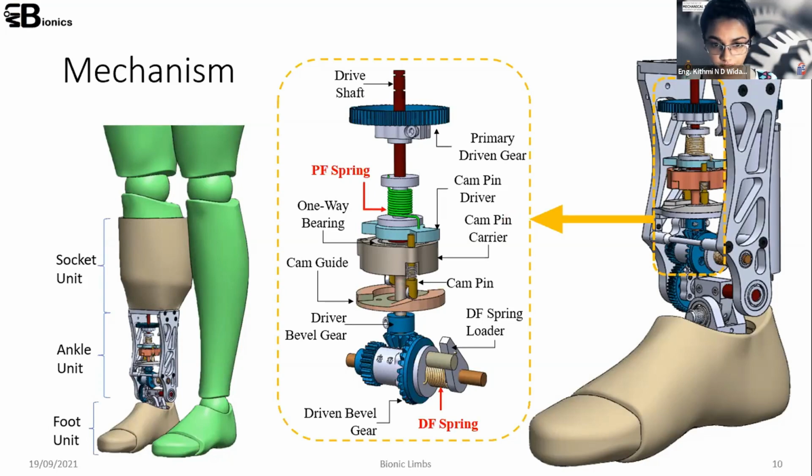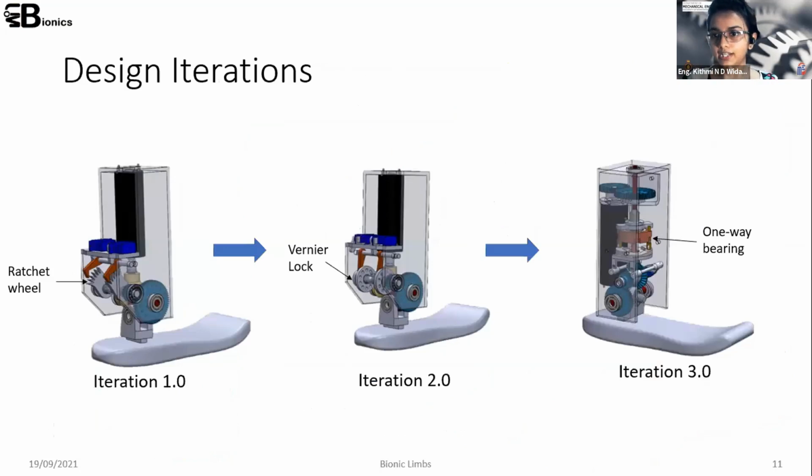So I'll move forward. As I told you, that design didn't come together all at once. After identifying the requirements, we first came up with different design solutions, like locking the springs.